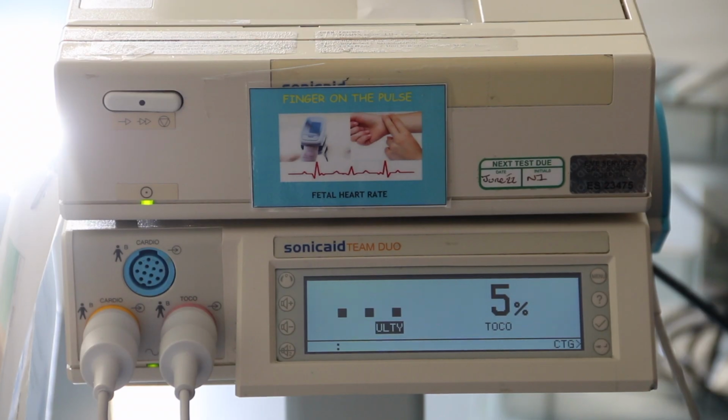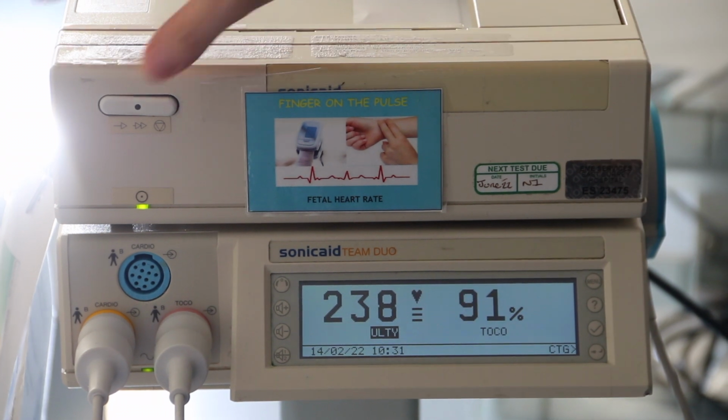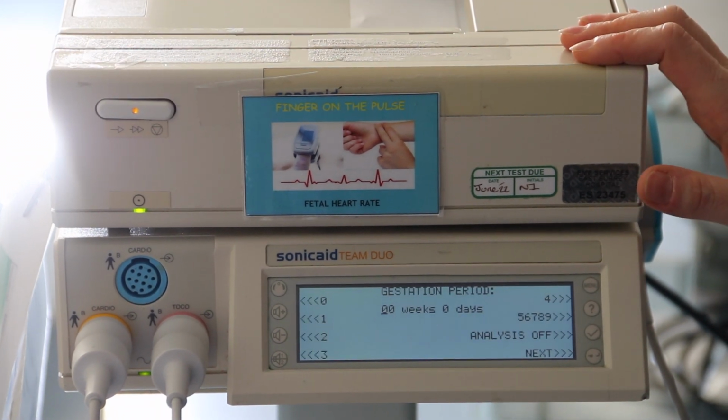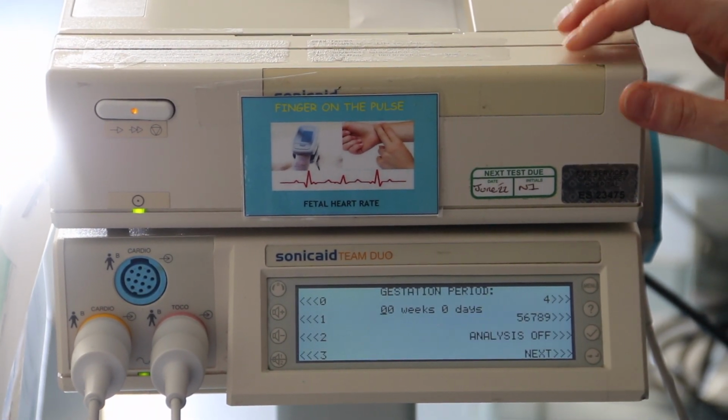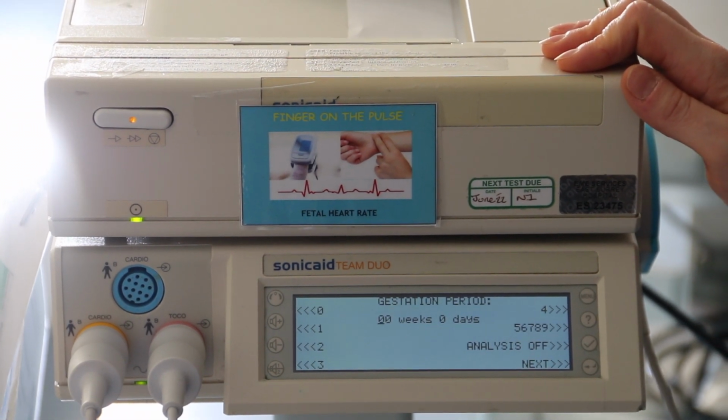at the back. Once the machine's switched on, you can attach the CTG as normal and then press the print button. Once you do that, the machine will beep because it wants you to enter the gestational information in order to start the Dawes-Redman analysis.